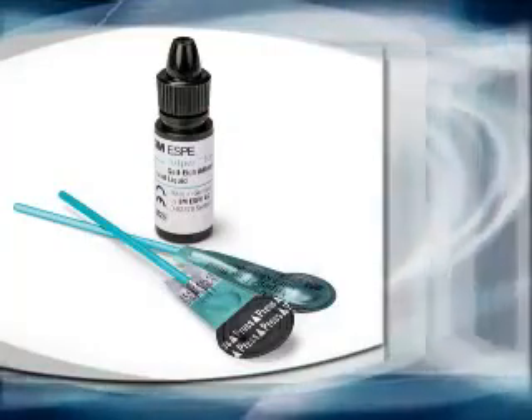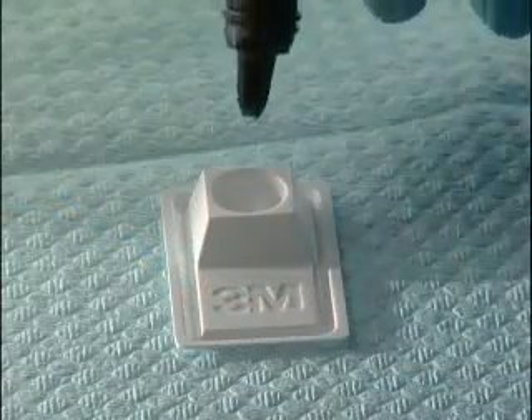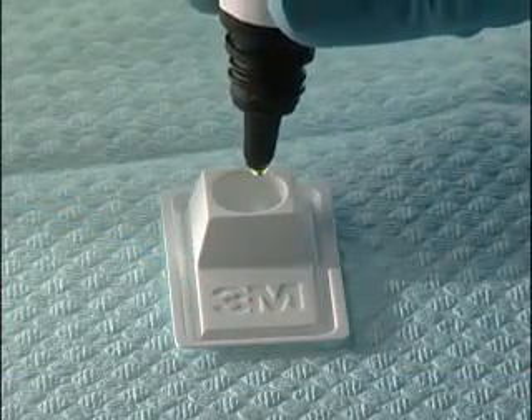Adper Easy Bond can be dispensed in either a vial or unit dose dispenser. For the vial, a drop of Adper Easy Bond is simply placed in the dispensing well.